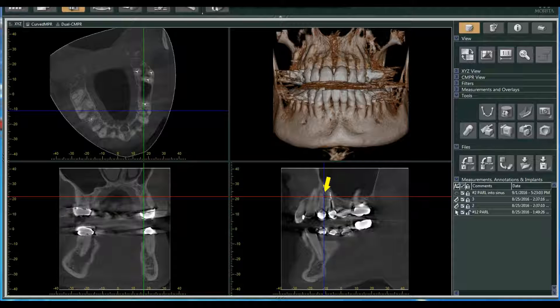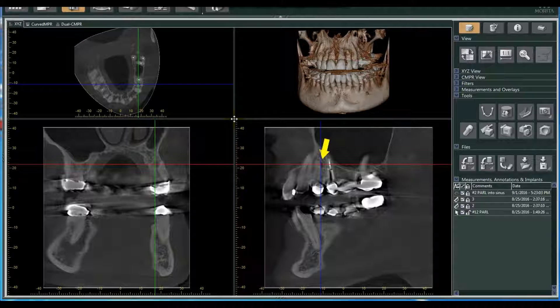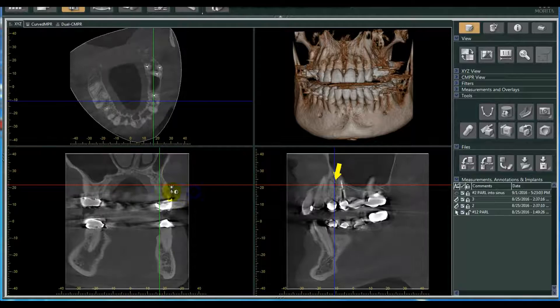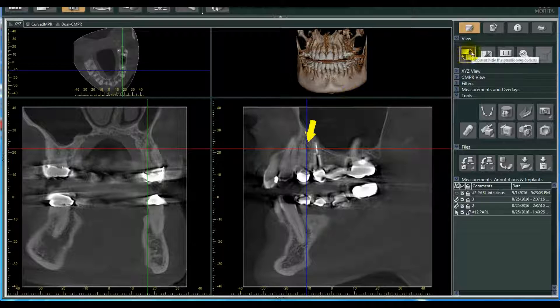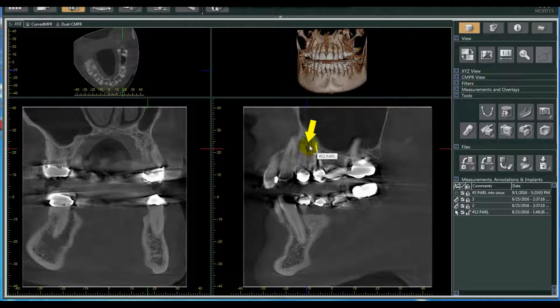Now I was about to leave without showing another patient image. I've cropped the top of the screen to remove the patient's information and keep it confidential and anonymous. In this image, you can see this is a different patient — we've got a lot more crown and bridge work, so you're going to see some more scattering in that 3D rendering. I'm going to clean this up and brighten it a bit. This is a patient who came in complaining of some issues with number 12. Number 12 has a crown and she has a periapical radiolucency there where that arrow is — it looks like it may be on the side of the root, possibly a lateral accessory canal.